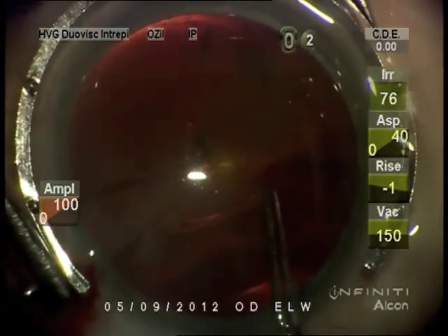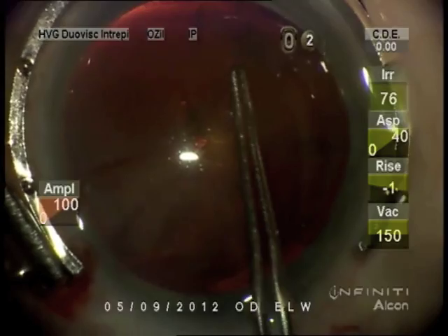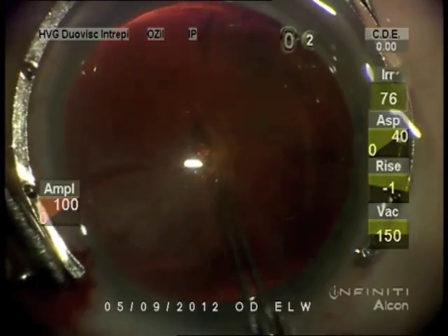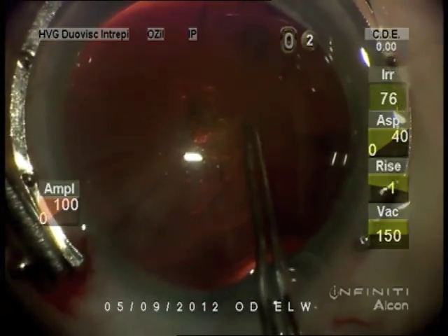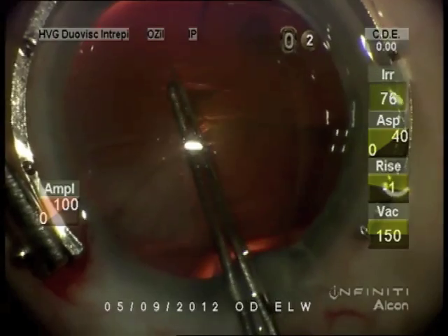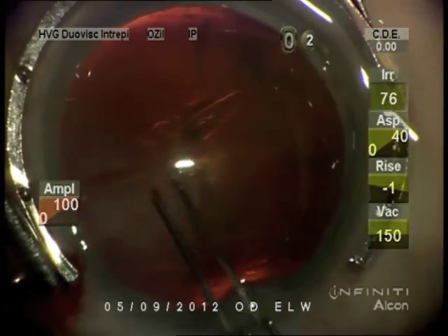And see, I just puncture the capsule, then take one of the point of tears. If you can always be pushing away, lifting a little bit, you get a vertical.